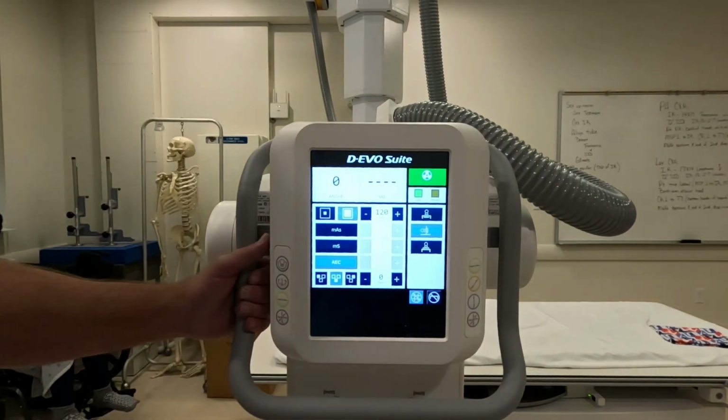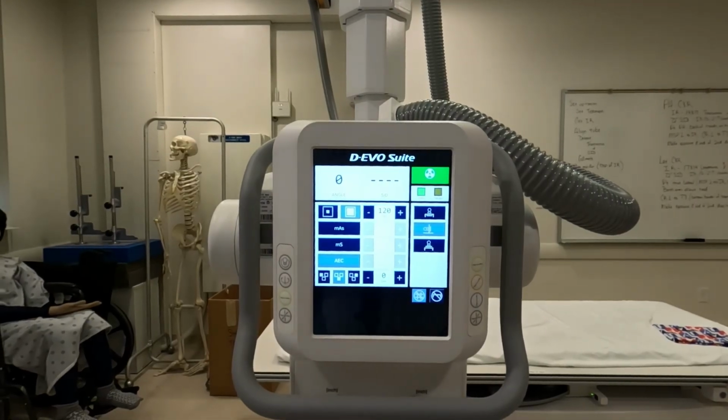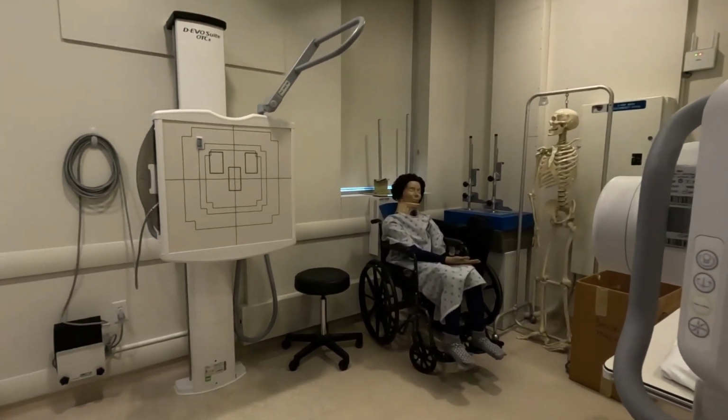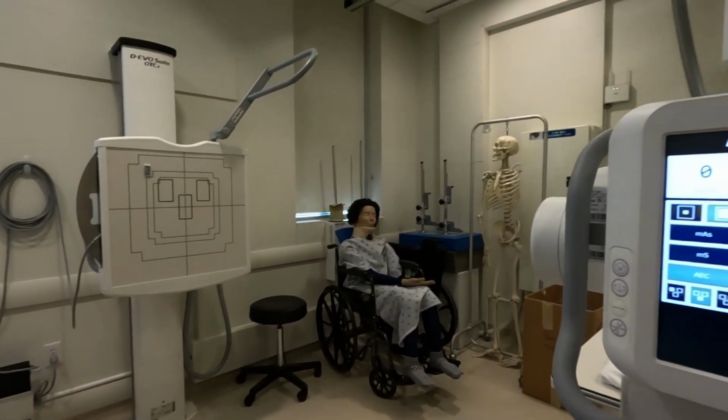So what you heard just now was it locking into its preset detent. So if I'm shooting a chest X-ray, and I apologize if the motion is a little much, that's what my machine is set up for, is chest X-ray. That's our wall bucky right there. And our chest X-rays, we want to shoot at 72 inches.